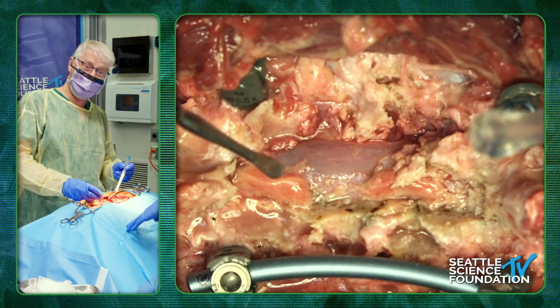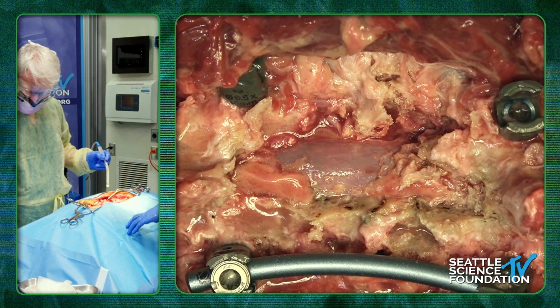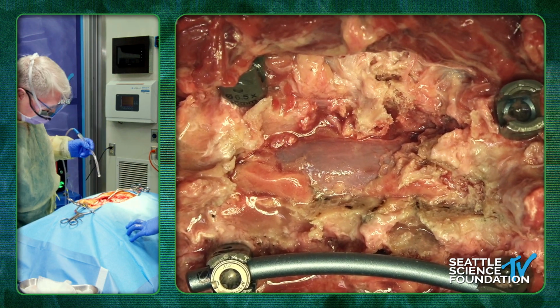So now what we're going to do is we're going to just get rid of the rest of this pedicle.